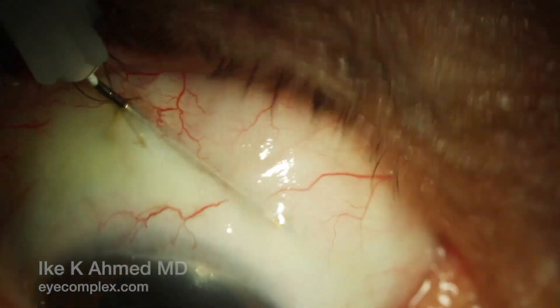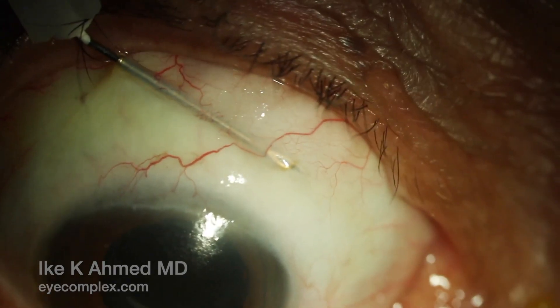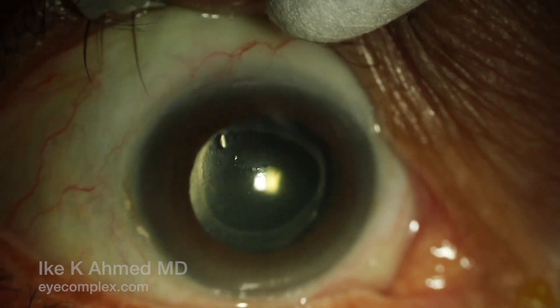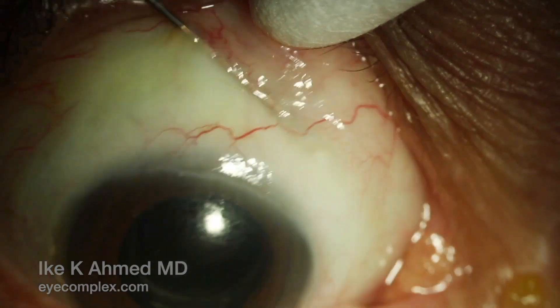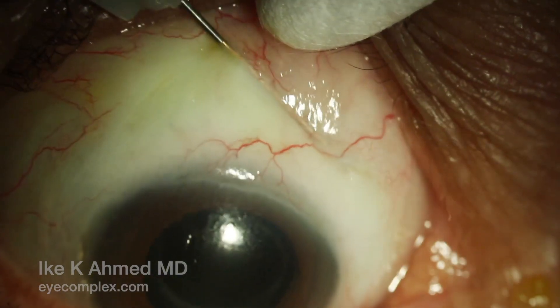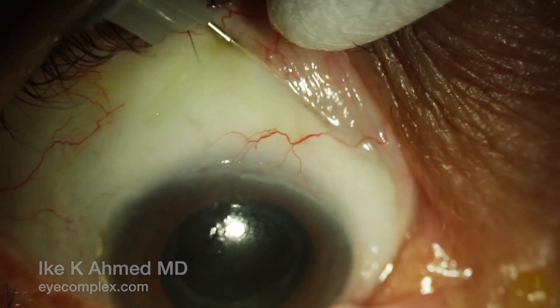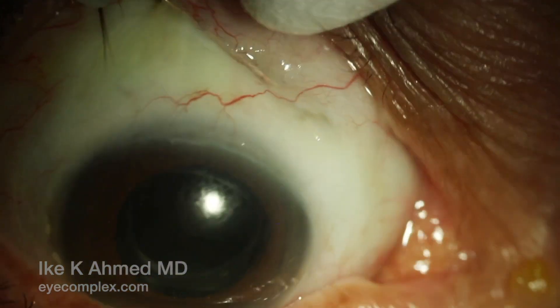The slide and sweep technique is used to cut fibrotic tissue around the implant. You can see the needle bevel is under it, and now we basically sweep toward the fornix. This is a fairly vigorous maneuver to ensure that we have cut fibrotic tissue around the implant. This is done numerous times, sweeping widely, trying to get under the implant preferentially to ensure we release the typical fibrotic web or scar tissue overlying the implant.